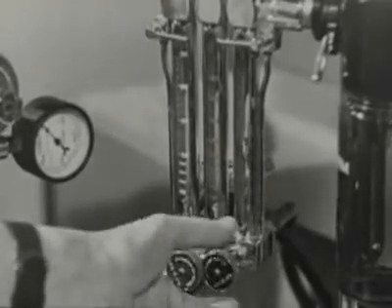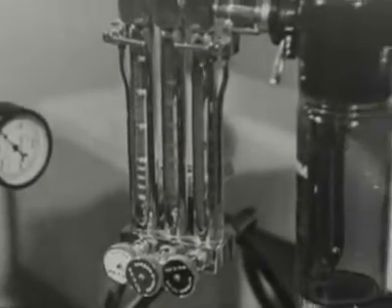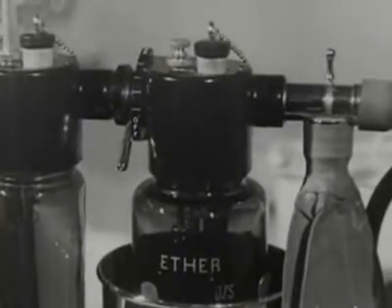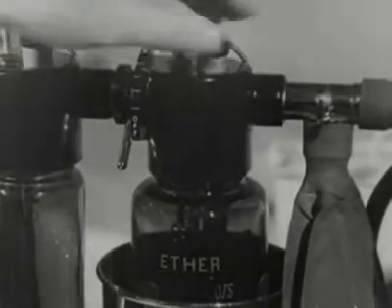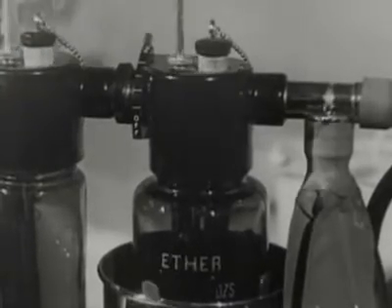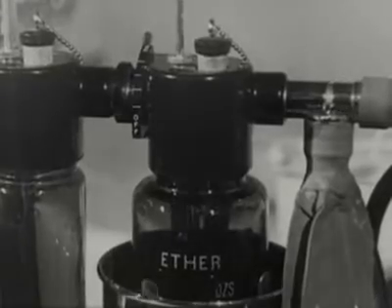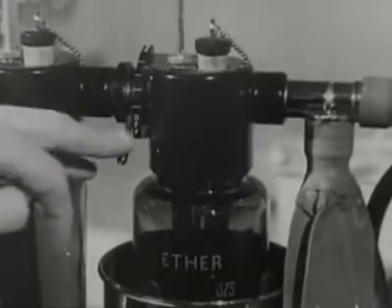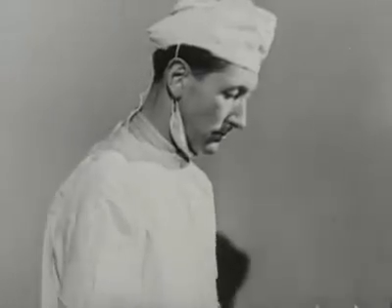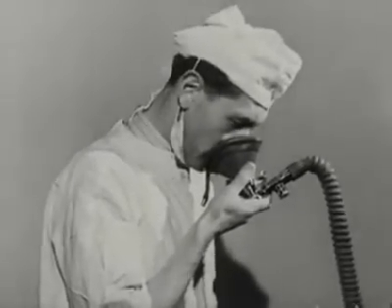Turn the nitrous oxide on to a flow of 10 liters a minute. Next, clear the J-tube of any liquid ether. Turn off the rebreathing bag, raise the plunger, and turn the ether tap full on. The flow of gas through the J tube will immediately clear any liquid ether away. Now turn the ether tap off and the bag on again, and smell the mask to make sure that no ether vapor is coming through.